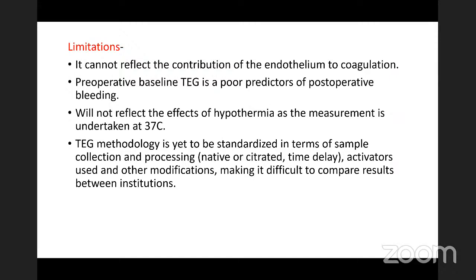The limitations of TEG are it cannot reflect the contribution of endothelium to coagulation. The preoperative TEG is a poor indicator of postoperative bleeding. It will not reflect the effects of hypothermia. The TEG methodology is yet to be standardized in terms of sample collection and processing, activators used, and other modifications, making it difficult to compare between institutions.